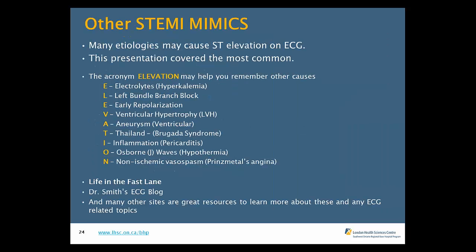Thanks, Matt. So that's a really quick and dirty review of some of those key STEMI mimics. Like Matt said at the beginning, there are all kinds of them. Whether the elevation mnemonic does anything for you or not, there's a list of some of the other causes of ST elevation, again with varying degrees of prevalence. And at the bottom there you also see a couple of resources that we've alluded to. Life in the Fast Lane is a great, comprehensive, free, open access resource with all kinds of examples and correlating information for ECGs. That's a great website.